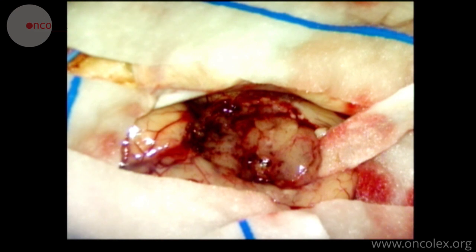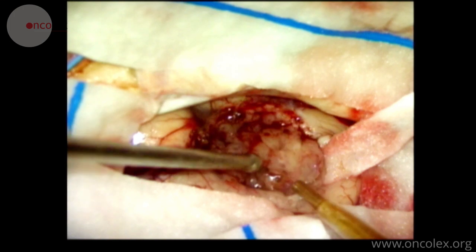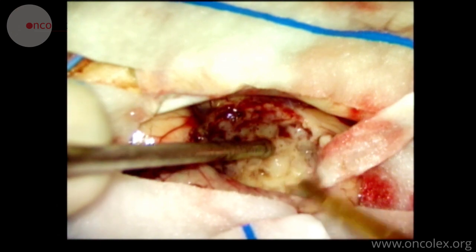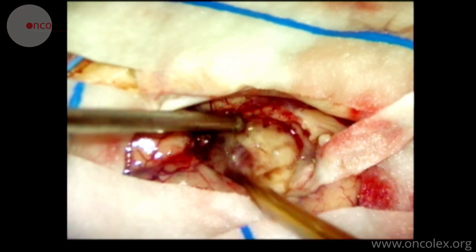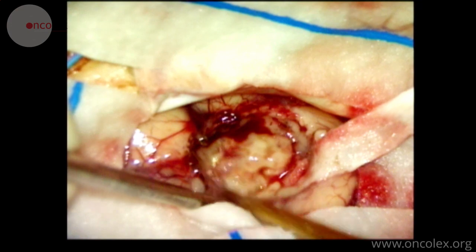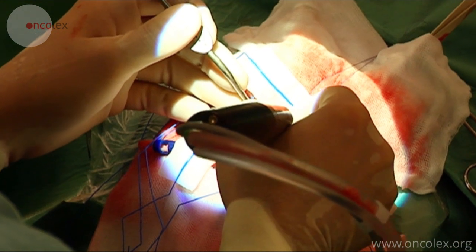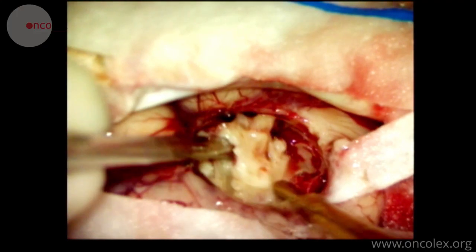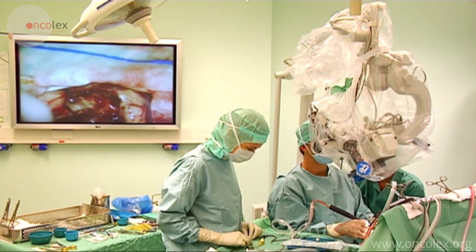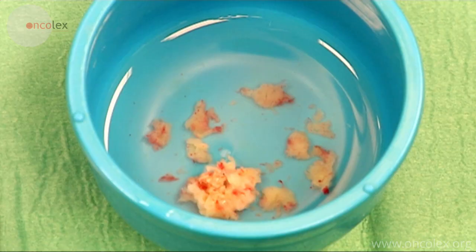All visible tumor tissue is resected using the Cavitron ultrasound unit. This instrument hits the tumor tissue with ultrasound waves while simultaneously flushing and sucking. Here we see several bits of the tumor.